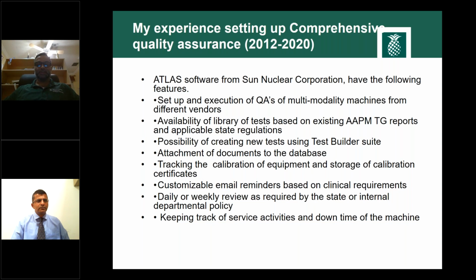documents to the database. So for example, every year here in the USA, all the registered linear accelerators have to get an OSLD from MD Anderson. They have a program called RPC, Radiological Physics Center, and they send a calibrated OSLD. We calibrate our machine according to TG51, and then we expose it with the prescribed method, and we send it back to them within 1 to 2 weeks.